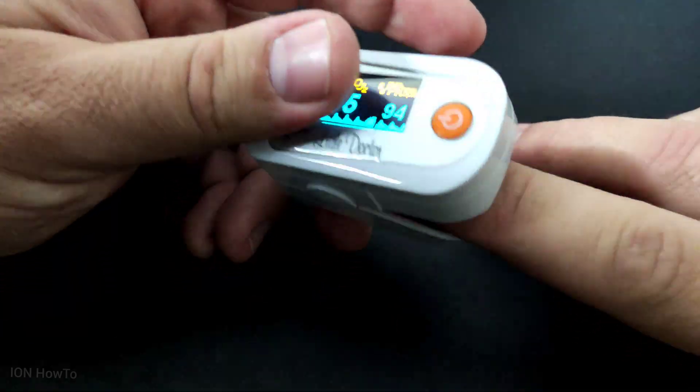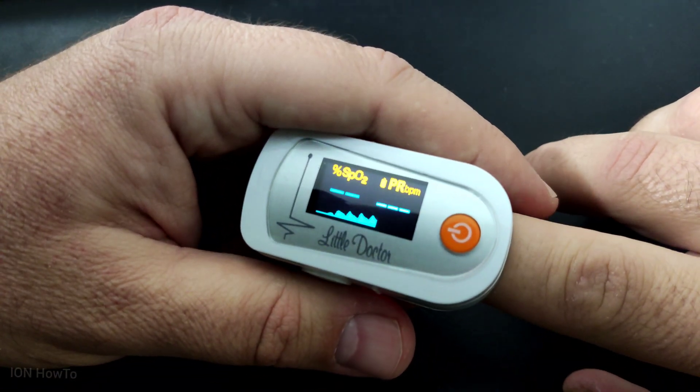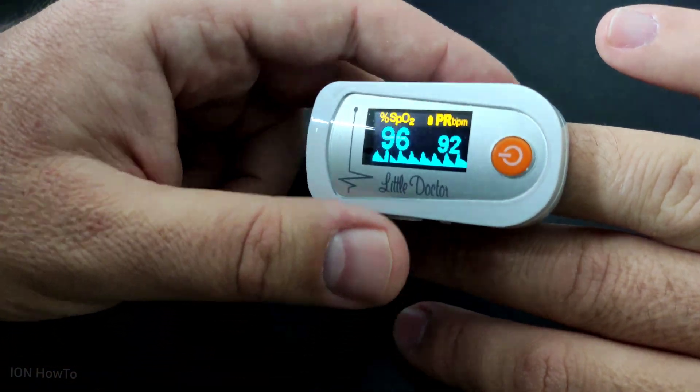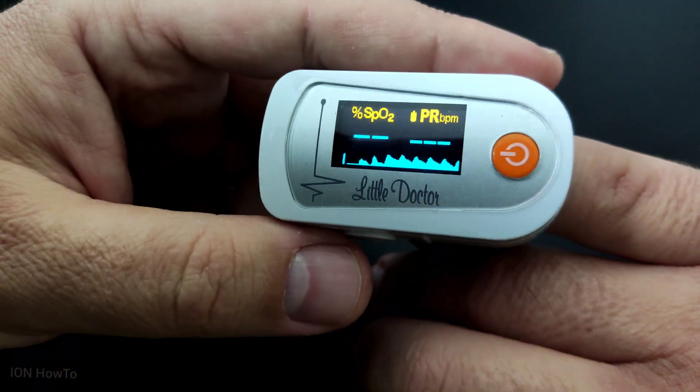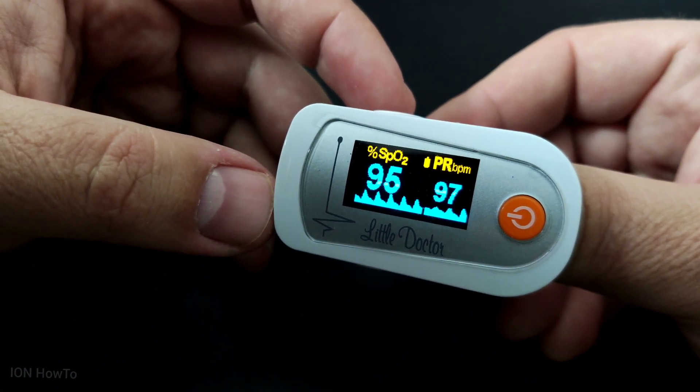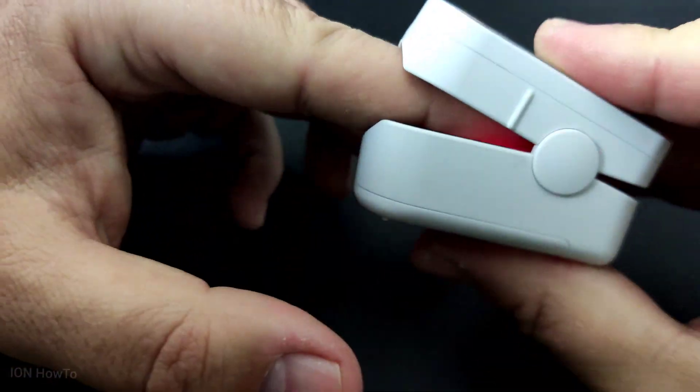Even 95 is a bit strange. I don't know why in some fingers it shows 96 or 97, but sometimes it shows 95. I guess you have to leave it running longer.